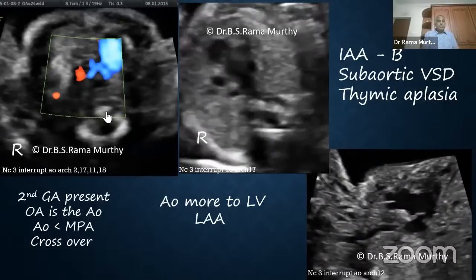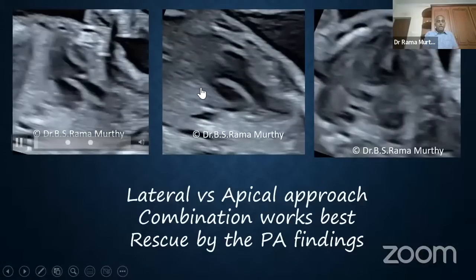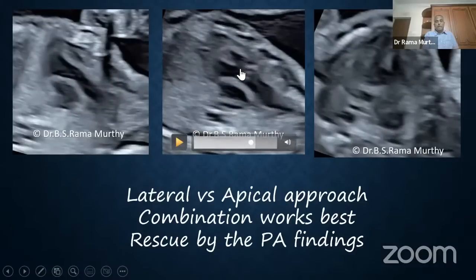Okay, now let's look at this. Aortoseptal continuity. Now, let me stop this. Let me go there. Again, an LVOT. Let me look at the aortoseptal continuity. There is a discontinuity. Is there malalignment? No, the collinearity is maintained. So maybe a perimembranous VSD.